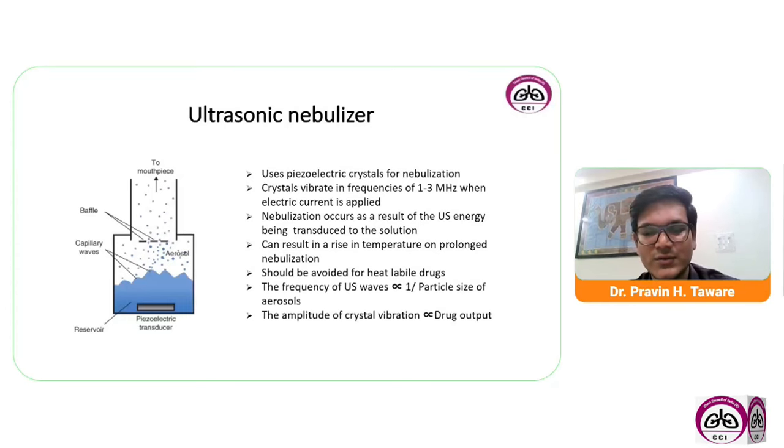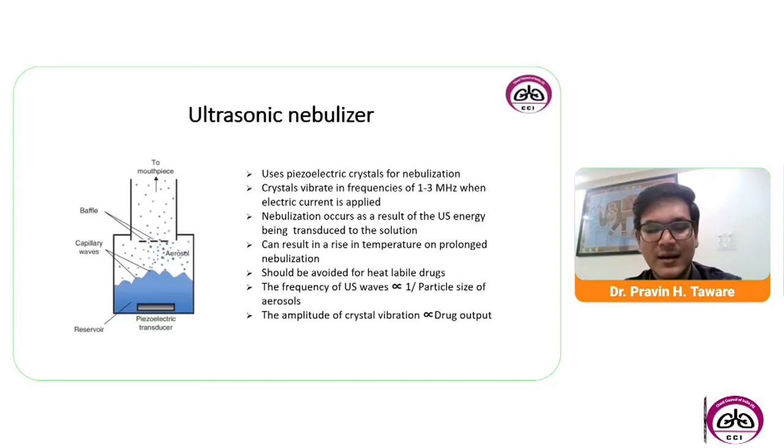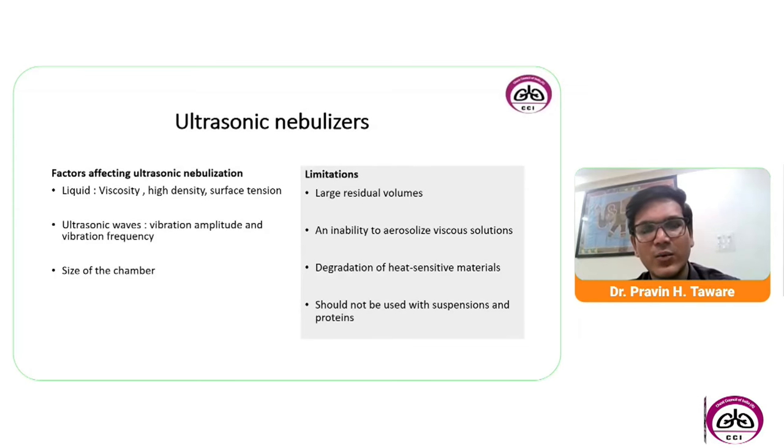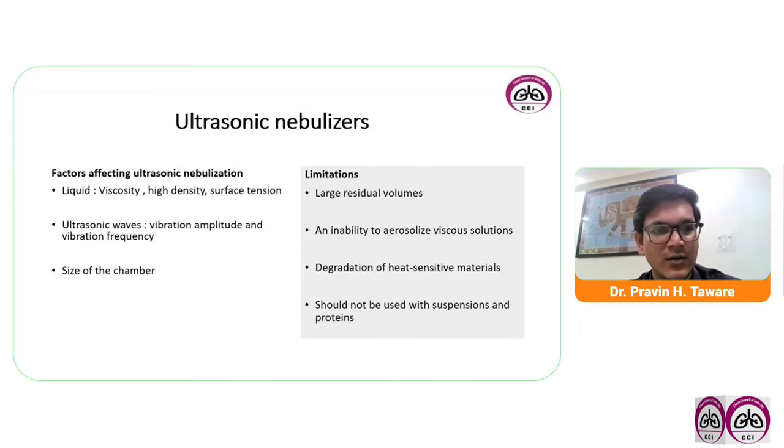The frequency of ultrasonic waves is inversely proportional to the particle size of the aerosols, and the amplitude of the crystal vibration is directly proportional to the drug output. The factors affecting ultrasonic nebulization include the viscosity of the liquid, high density of the liquid, surface tension, vibration amplitude, vibration frequency, and the size of the nebulizer.